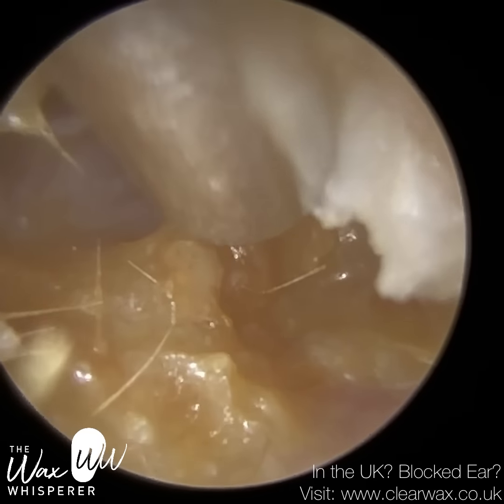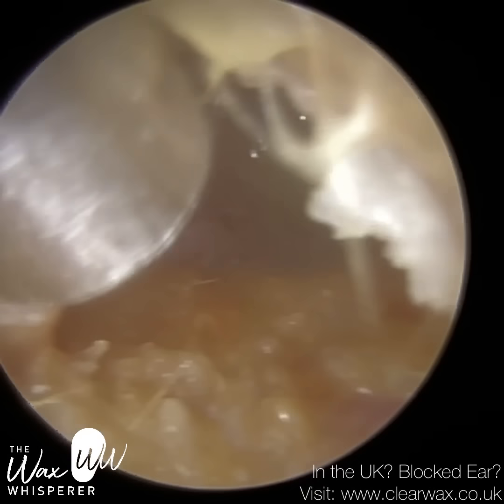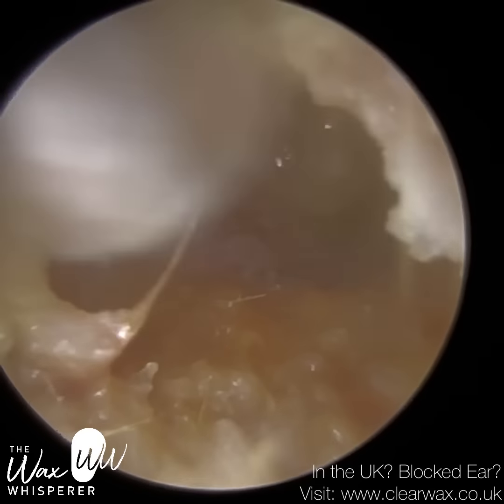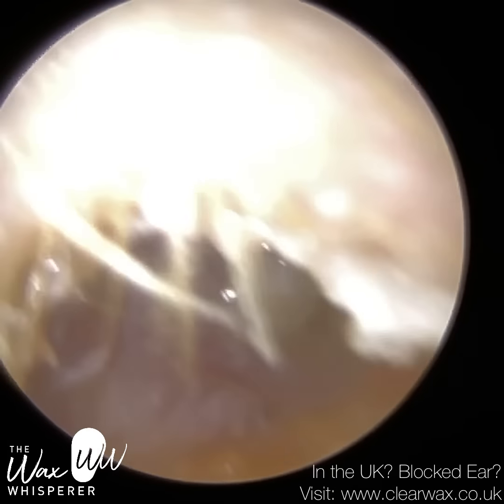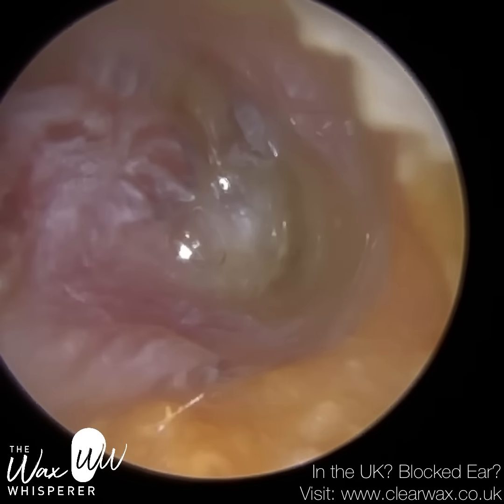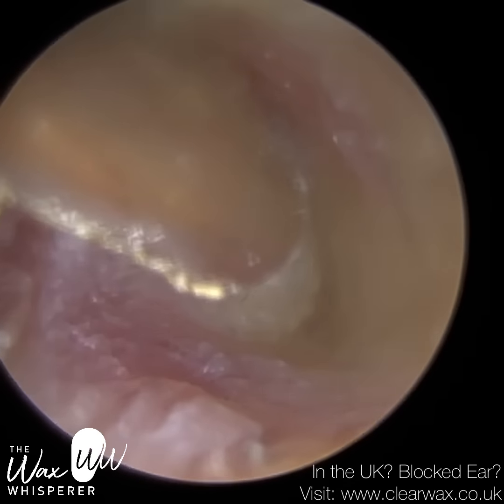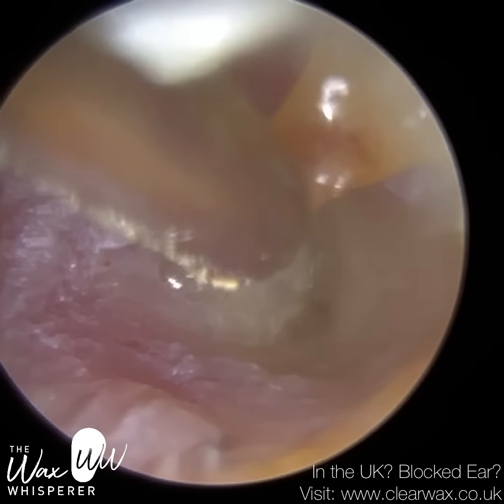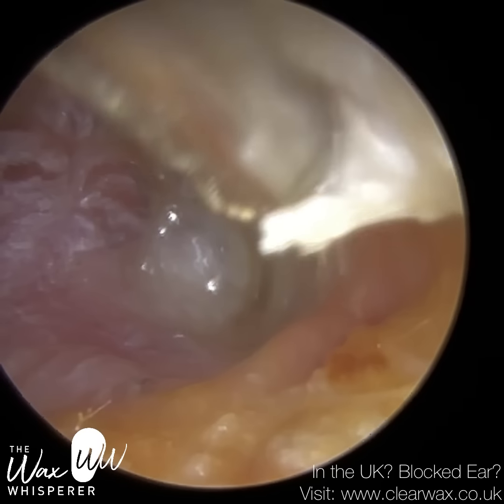The reason I say that is because, as well as this outer ear infection called otitis externa, as you can see, I'm just performing microsuction and removing all this dead skin, debris and outer ear. They are also suffering from a middle ear infection called otitis media, or more specifically, acute otitis media with effusion, which is also typically known as glue ear.